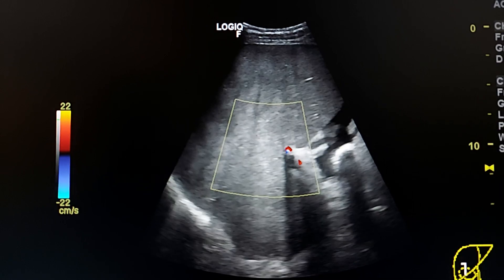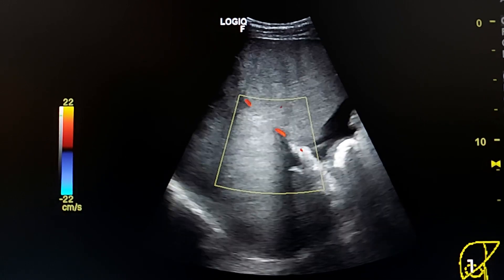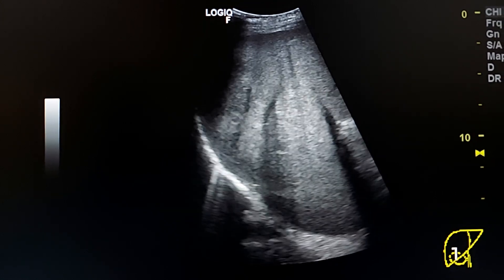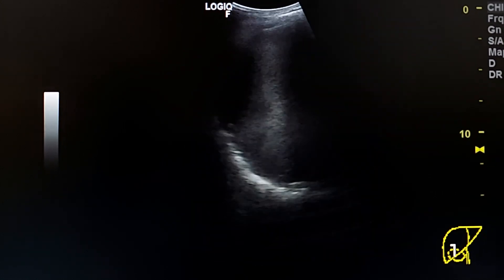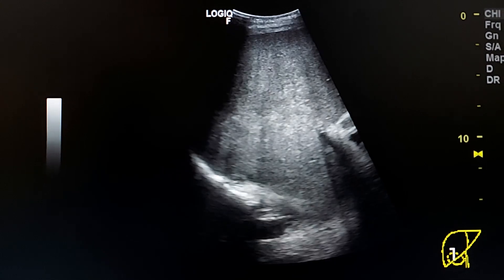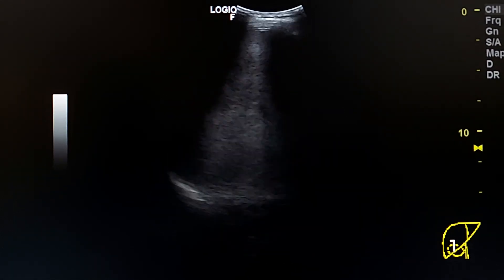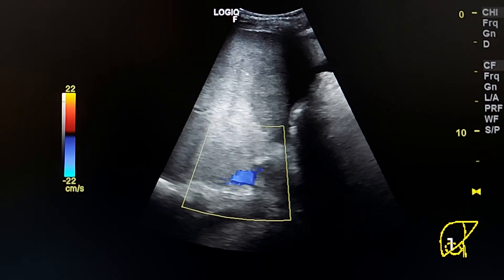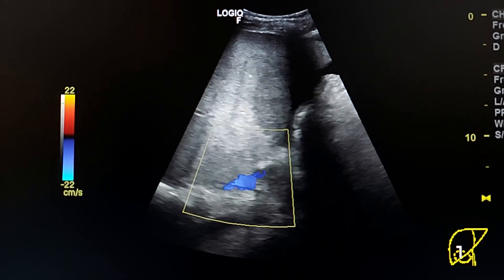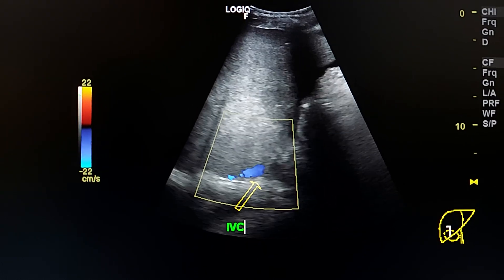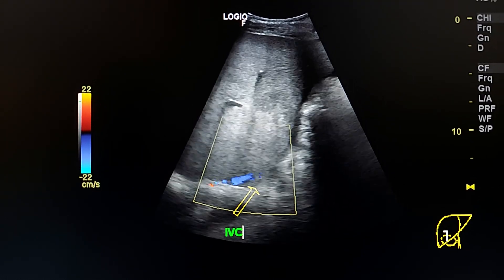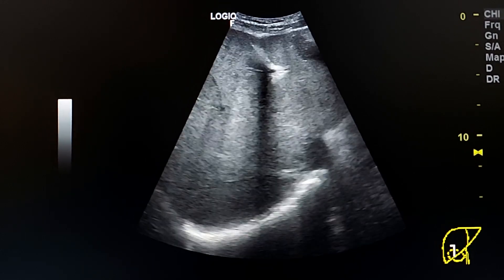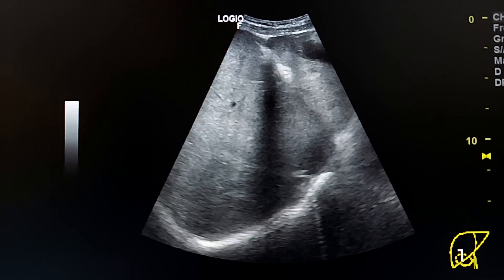The ecotexture of the liver is heterogeneous and hyperechoic. Here we see the IVC, which is patent. This is the IVC. Here we see the heterogeneity of the ecotexture again.